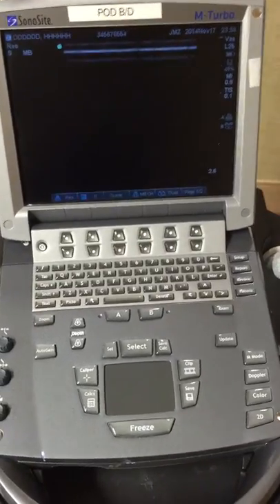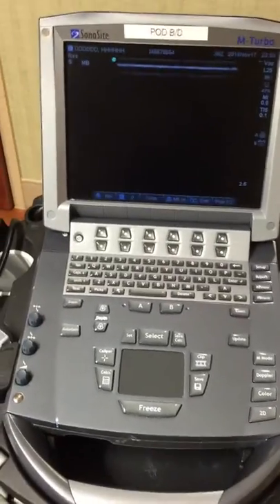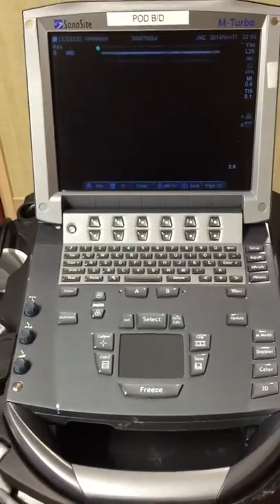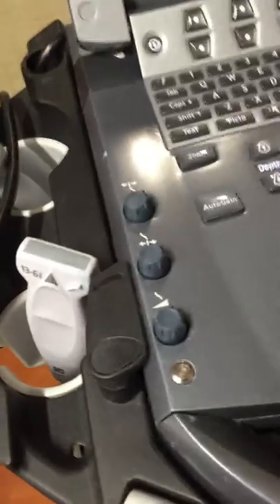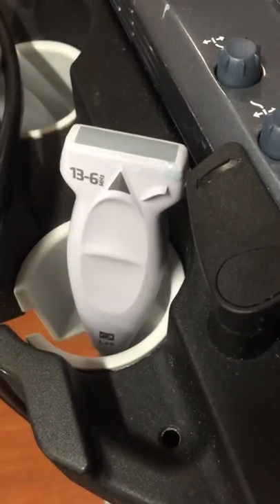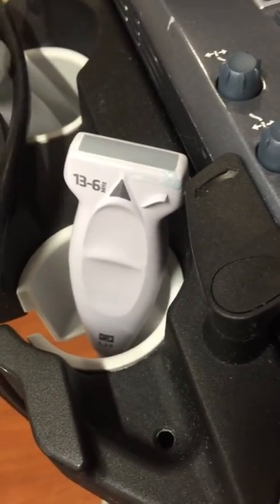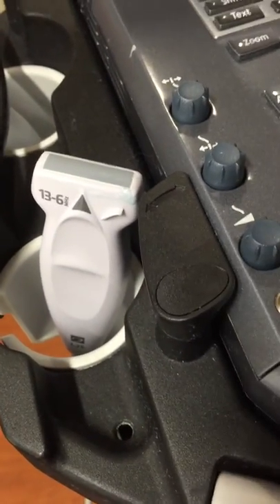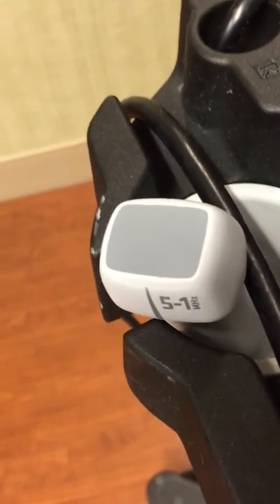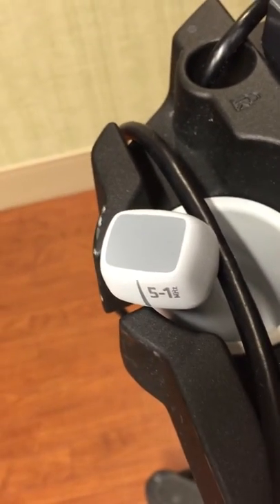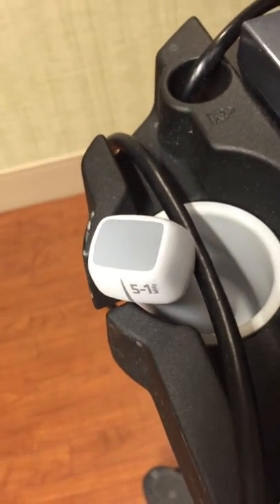Secondly, picking the right probe. Most machines we use have two probes. A linear probe, which is right there. That's more for your lines, superficial abscesses, and then your phased array probe is there. That's for your cardiac, your abdominal, and deeper tissue.